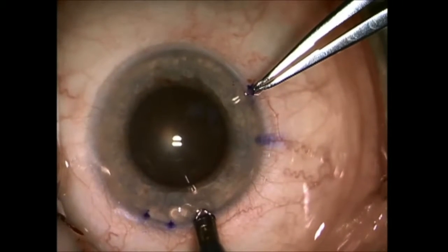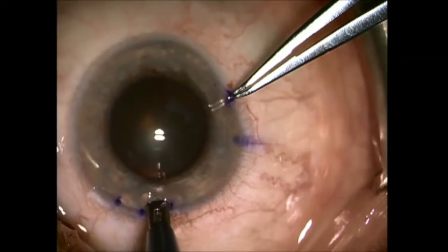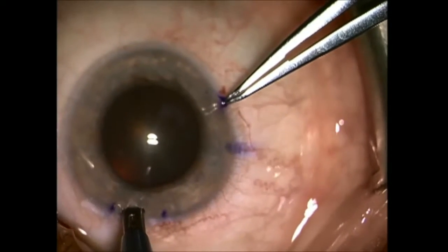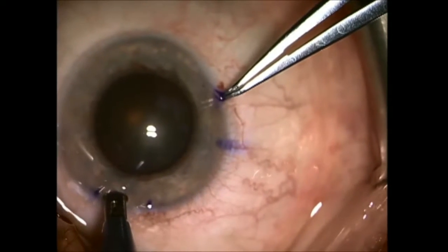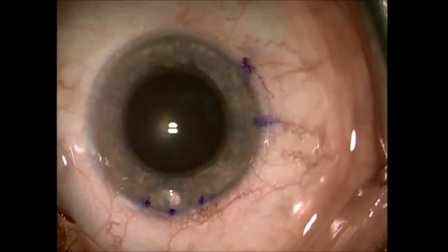I go in perpendicular to the cornea and in one gentle move drag the LRI blade and connect the three dots, then remove — and the LRI is done.